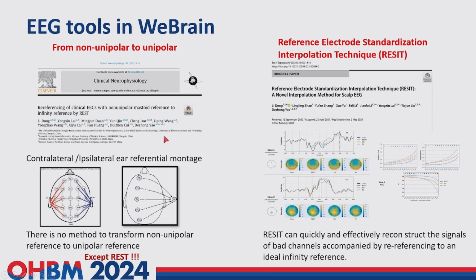So what is the advantage of REST? Here are two examples. First is the application in clinical EEG recording.